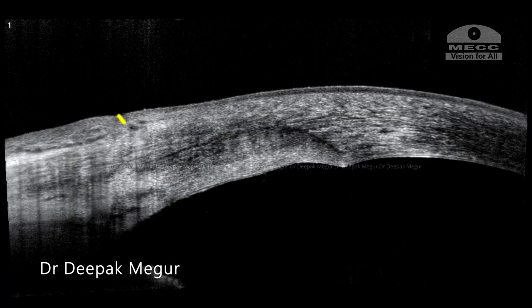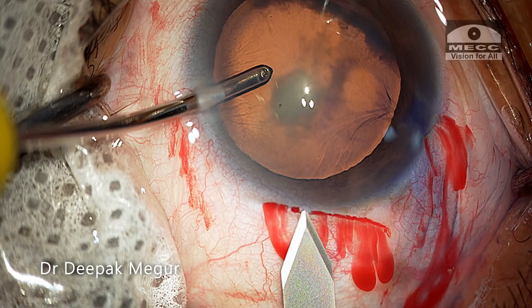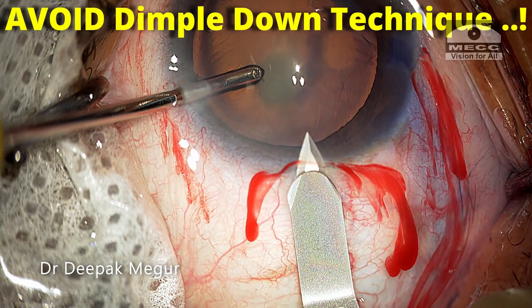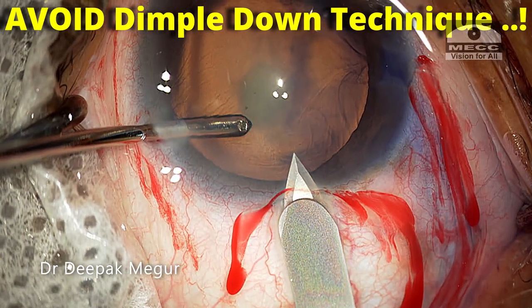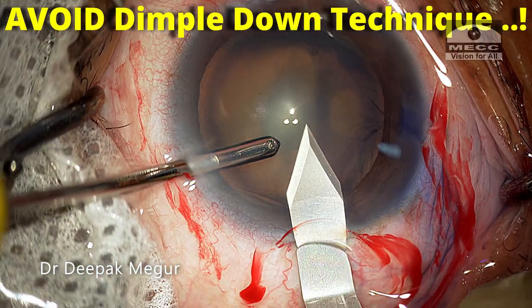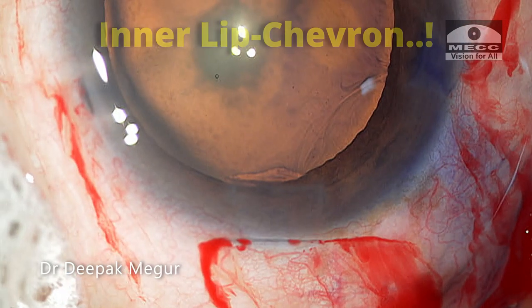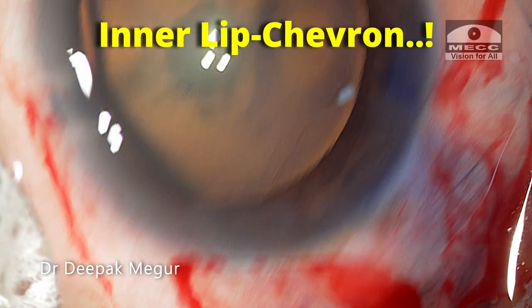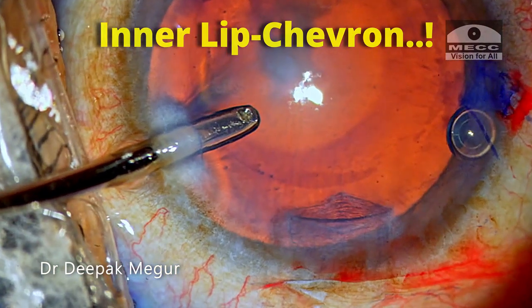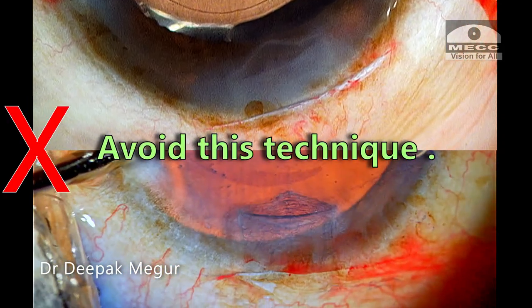Another similar OCT scan showing the triplanar nature of the incision. Let me remind you that in the quest for a triplanar incision, we should refrain from using the dimple-down technique, as elaborated in previous episodes, which gives rise to a chevron-shaped internal lip, which is not ideal. One needs to be careful and avoid the dimple-down technique.